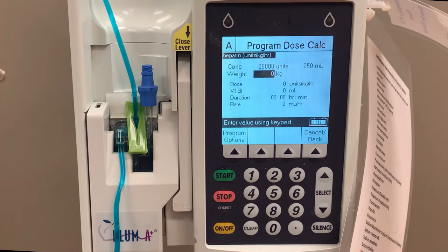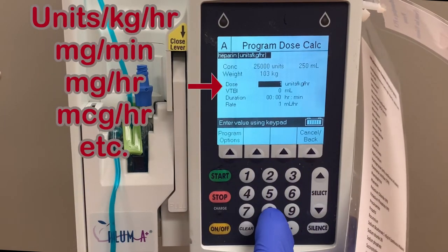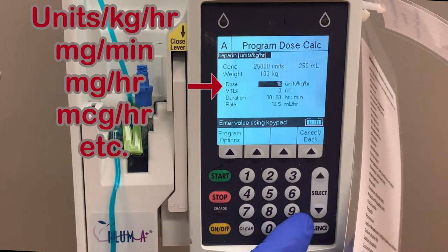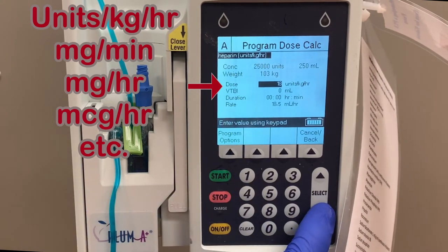Because we used the drug library, we are able to program specifically the information that is needed for this medication. The dosing for heparin is weight-based, so the first thing we do is enter a patient weight. The dose is entered in units per kilogram per hour. But this will not be true for every medication you program. Other medications will use a variety of different measurements.